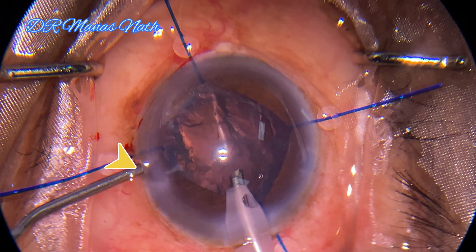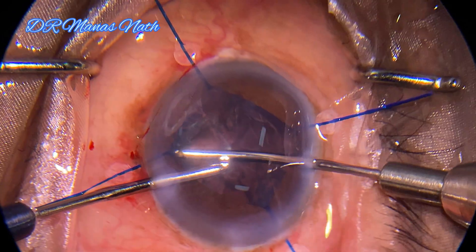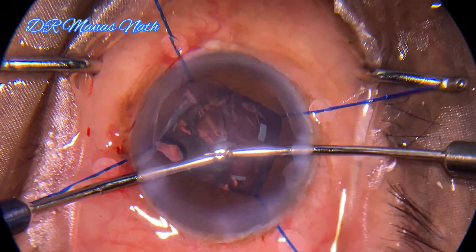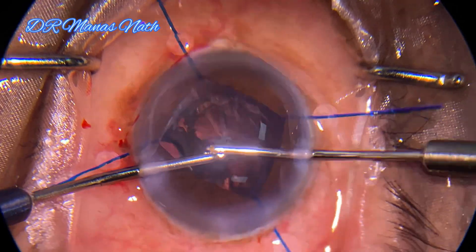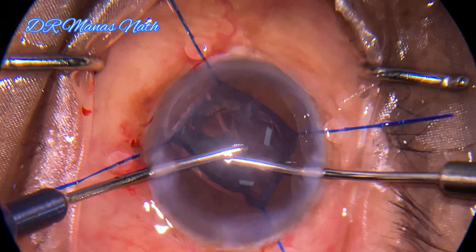You can see that the iris is still prolapsing through the sideport — that will allow the chamber to collapse. Now using bimanual irrigation-aspiration to remove the thin epinucleus sheet along with the cortex.